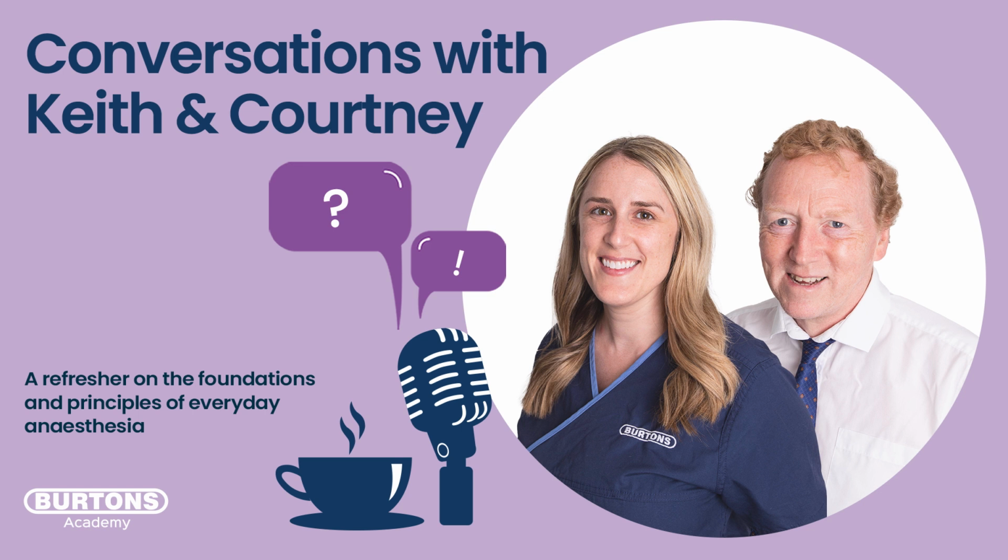But then I also think, am I just not supplying enough oxygen? And that's when I look over and you can see that the flow meter has been knocked down. Or actually, I even had an instance where the nitrous oxide, it was one of those electronic flow meters, so it's quite easy just to hit the knob and suddenly nitrous was being delivered to my patient as well. But also, have I not perhaps done enough to remove the room air out of my circuit system? I just start to think, is oxygen delivery somehow impaired as well?